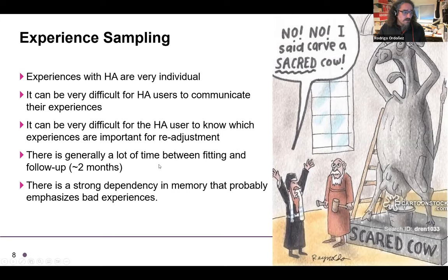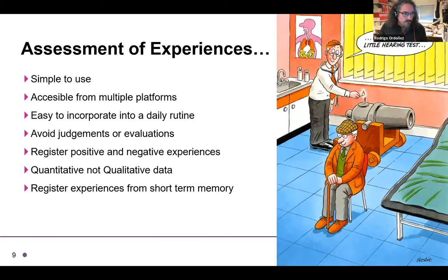There's generally also a lot of time between fitting and follow-up, approximately 2 months, and there's a strong dependency on memory for whatever feedback a user can give to the hearing aid provider. So in terms of assessing the experiences, any system used for this should be simple to use and accessible from multiple platforms. That means we should make it as accessible as possible for users. It should be able to be incorporated in a daily use scenario, so people could use it every day, hopefully.